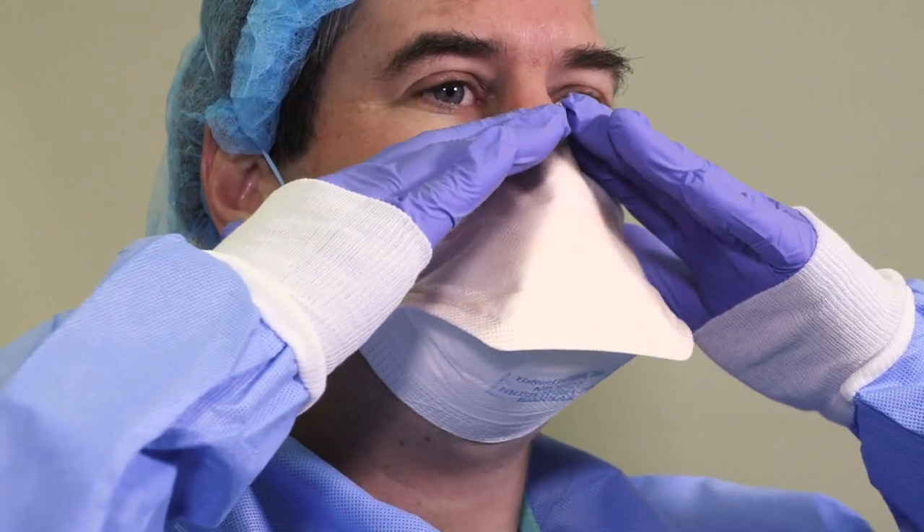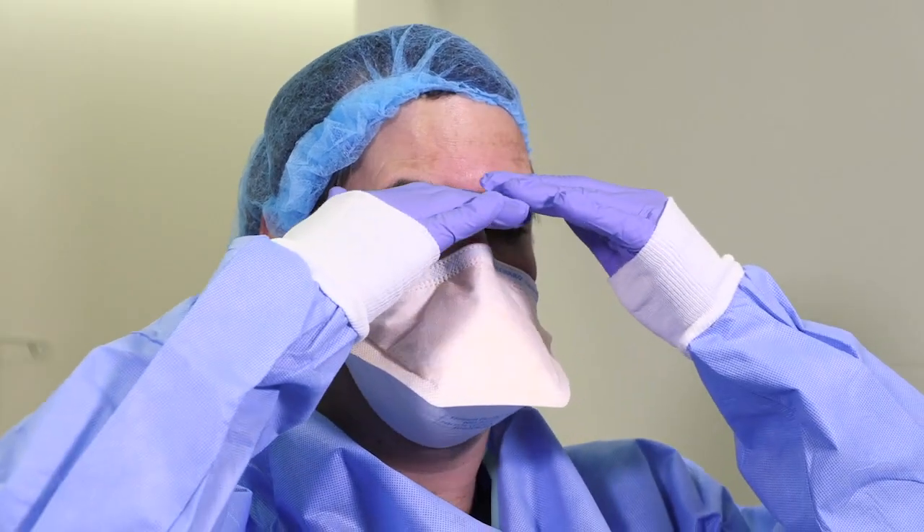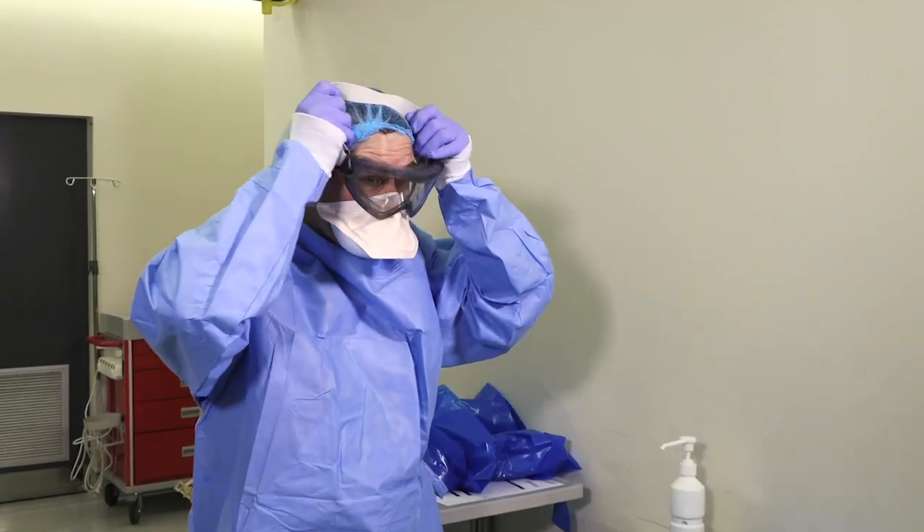Once you've placed it on, check for leaks. Forceful breathing in and out should make the mask move. You can use your hands and your eyelashes to feel if you're moving any air out through the mask. It should be just about a perfect seal. Next is eye protection.